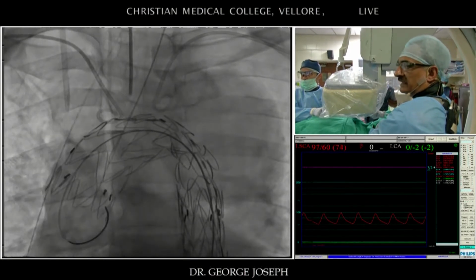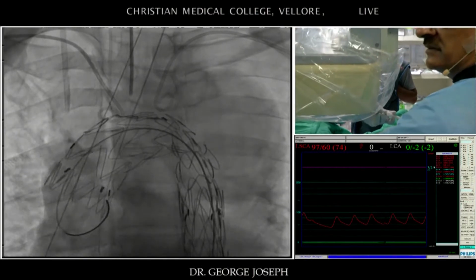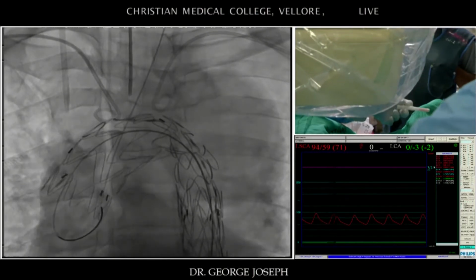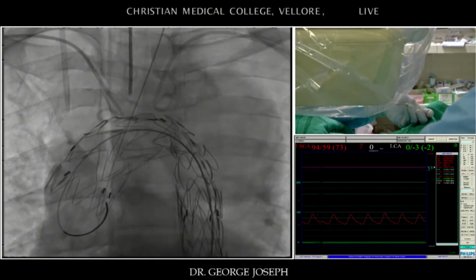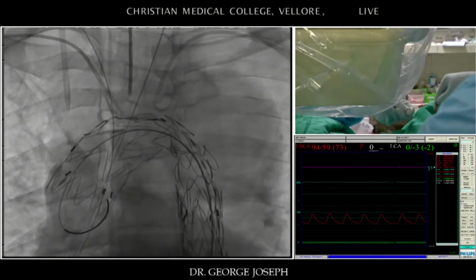I didn't have to do any manipulation whatsoever. So this system which we use, which we have devised actually, has not been reported before, but it's so precise that we generally spend less than a minute crossing the fenestrations.